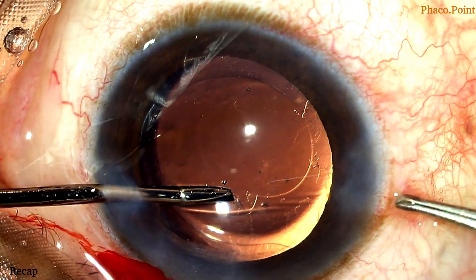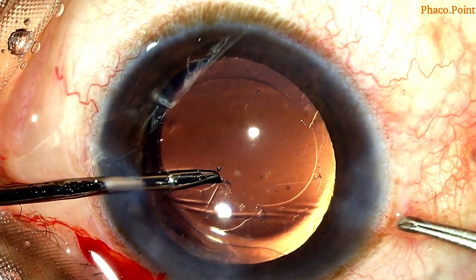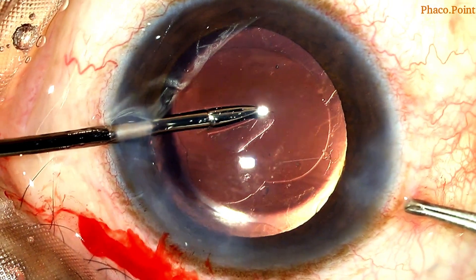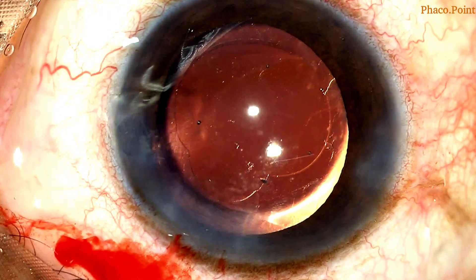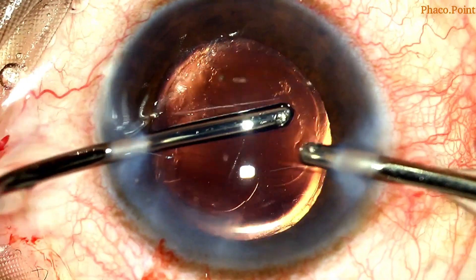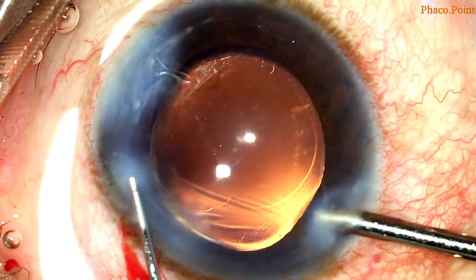Under adequate viscoelastic cover, after stabilizing the eye, the torn edge is held and using the shearing force like we do in creating a RHEXIS, it is suitably enlarged. We need to be mindful of the extent of the extension because it should never exceed beyond the optic. The lack of a nucleus underlying it gives you a different feel to this pull as opposed to when you create a RHEXIS.